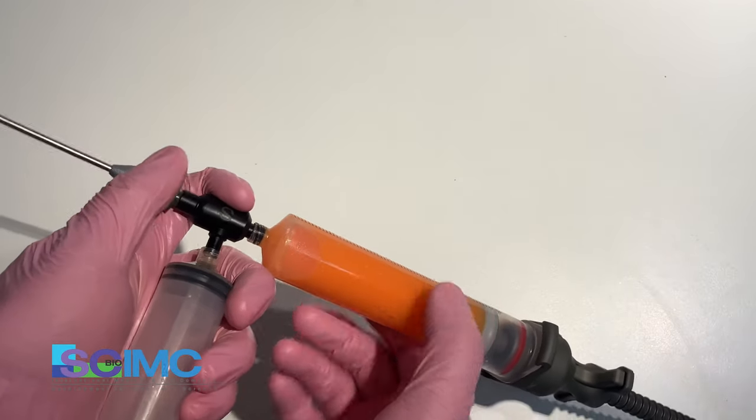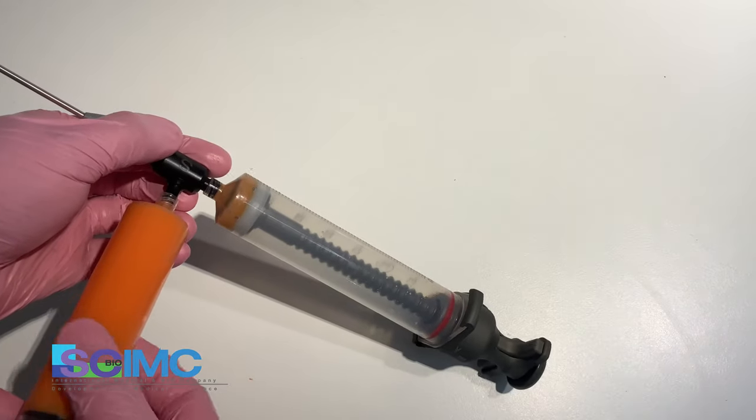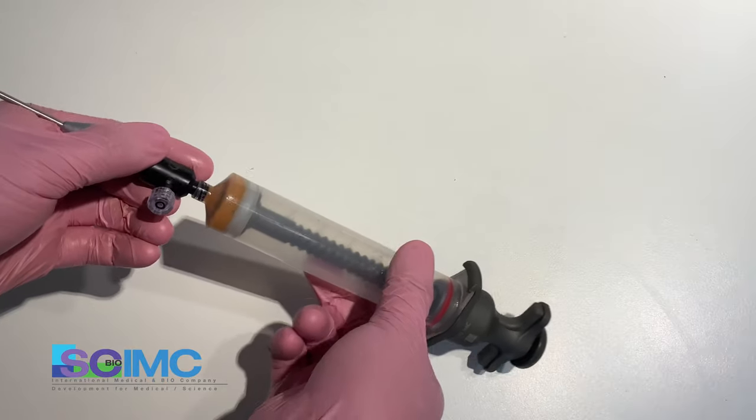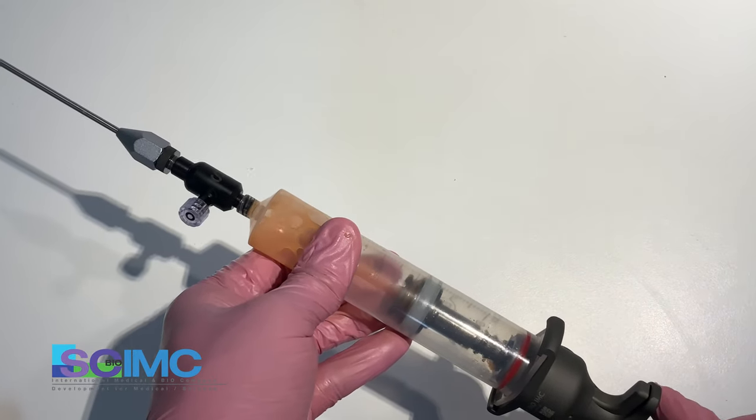Connect the empty syringe and transfer. Remove the syringe and close the cap for protection from contamination. And you can start harvesting again.